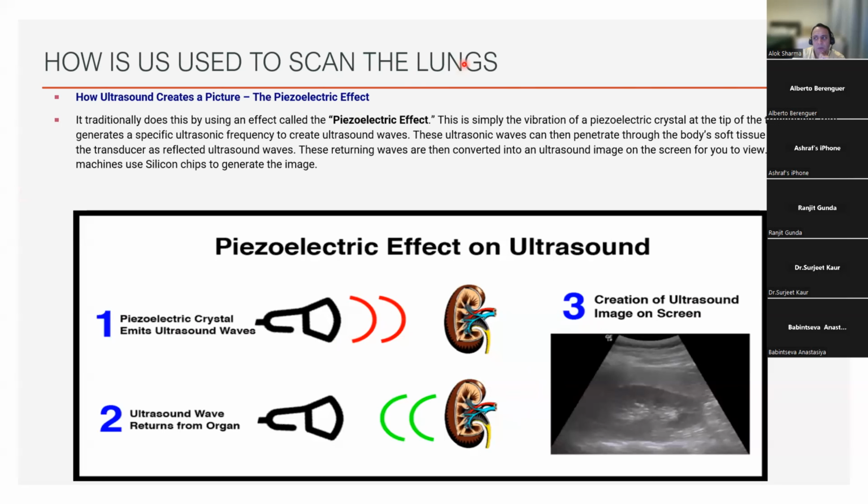But really, the way the ultrasound waves interact with the tissue doesn't necessarily conform to the rules that the ultrasound probe and machine apply. They interact in a variety of different ways, which then results in the image of the tissue and sometimes results in artifact. An artifact is something that is visible, but it doesn't actually represent anatomical tissue. It's more like a mirage. Now, what does that mean for us?